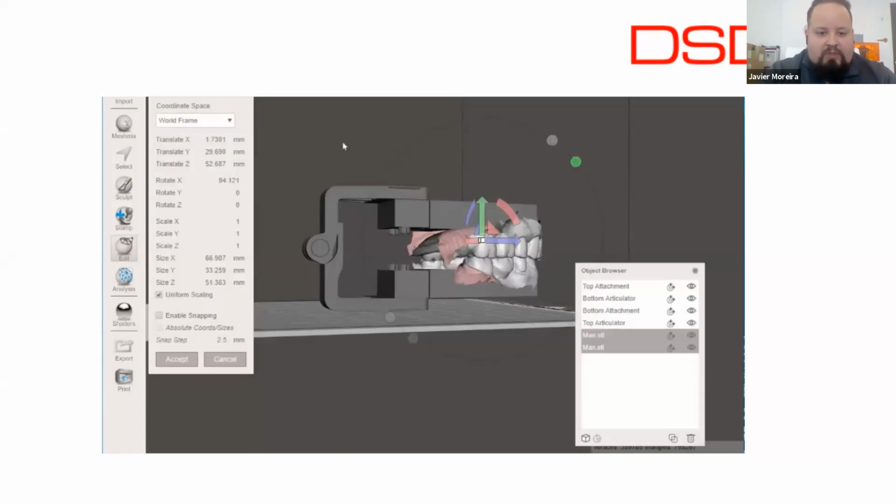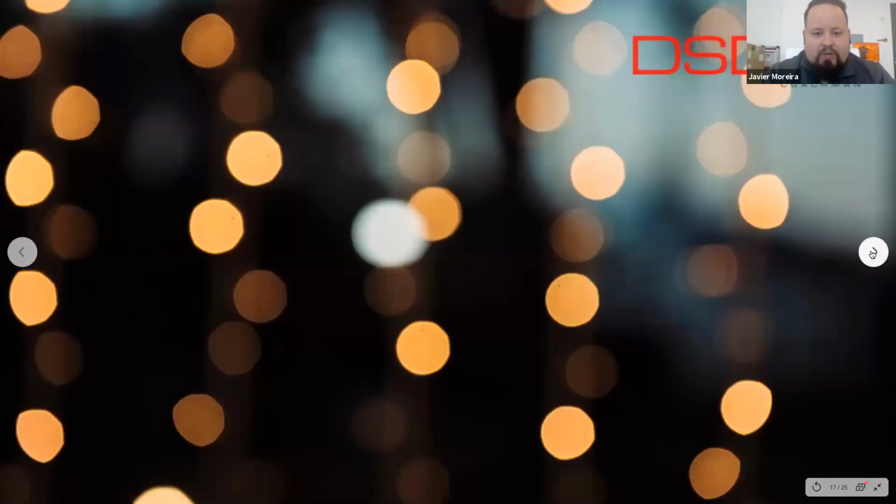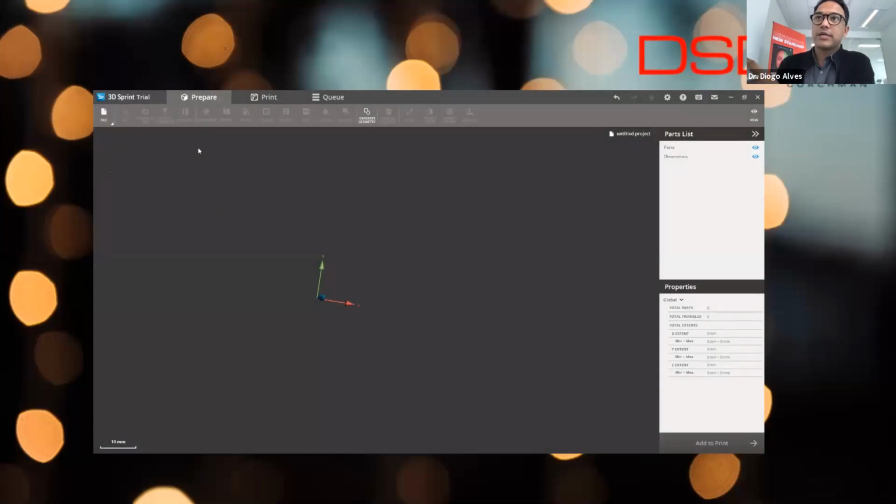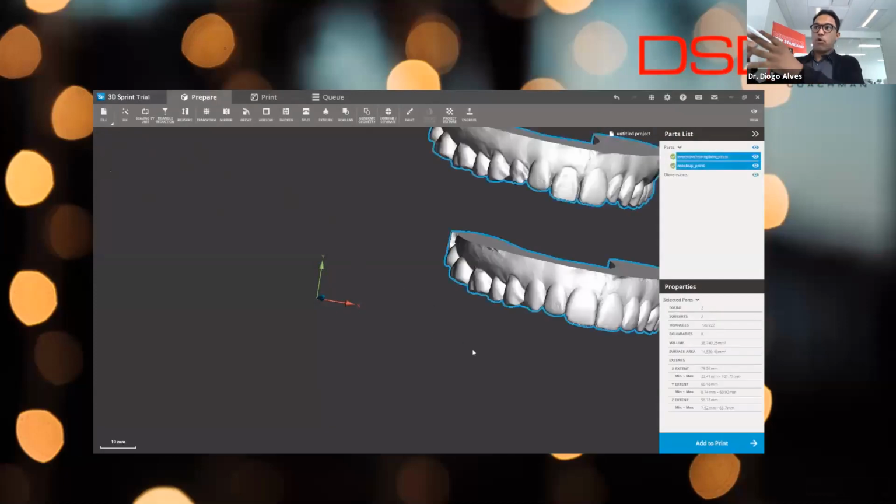Next, once we've cleared this and we know that it works, we'd be able to push on to the next step, which would be preparing it to actually print. So we want to take it from the digital to the physical. And that is something that you will also be explaining and teaching us, how you can export and then send it to print, right, Javier, in the course?